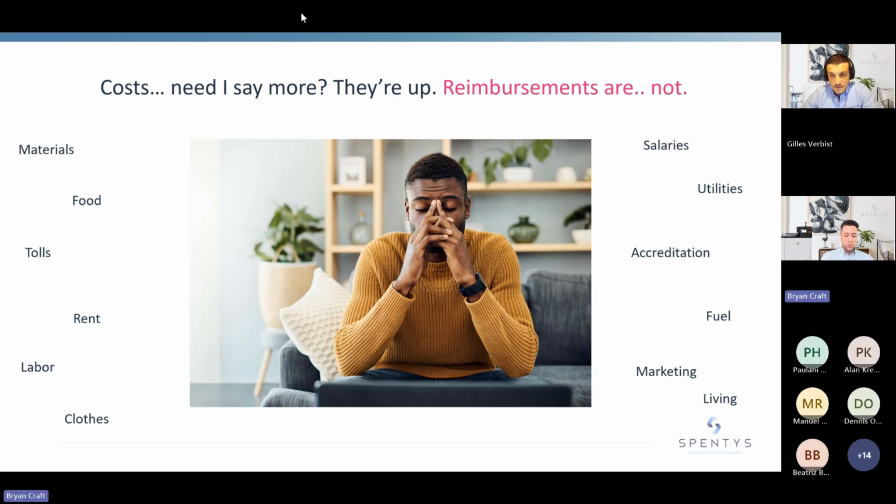And I think if we're trying to apply the same strategies and the same workflows and the same approaches that we were trying in 2016 in 2026, with that decrease of buying power of the US dollar, it's a recipe that is really tricky and challenging. So if you're in this webinar, I think you can very much align with, guys, our prices for everything have gone up. We need to be more efficient. We need to increase our throughput, and we need to be able to address this demand really simply. And that is what we have.